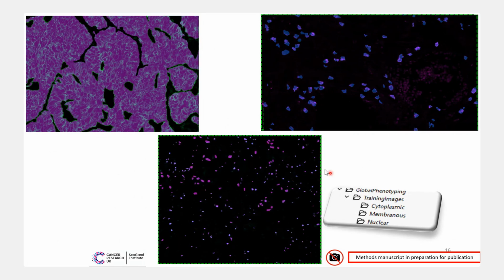And here you can just see, a little bit of housekeeping in Visiopharm, how I separated them into subfolders. The reason for doing this is, so this is a really bad drawing, but you can see that if we've got CD8 staining around the outside here in yellow, and then you've got the nucleus that would be in the middle, and we just did a nuclear segmentation, for example, the nuclear mask or label would be sitting inside this CD8 stain.